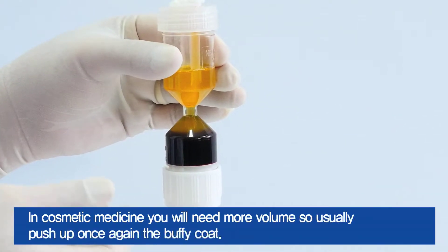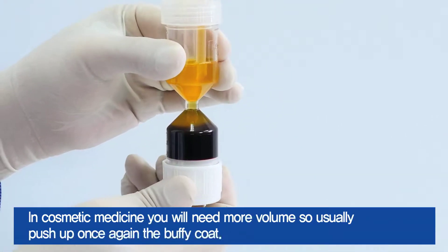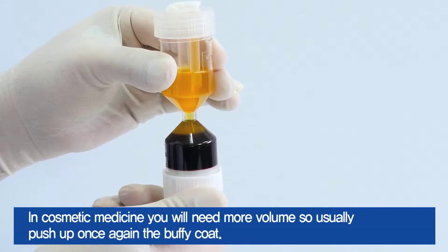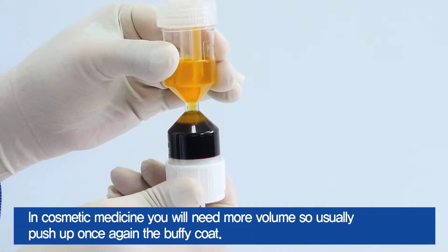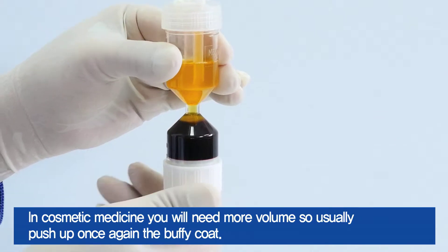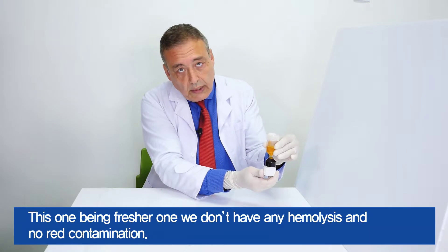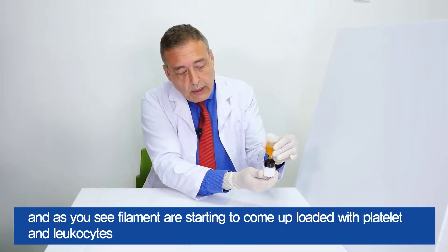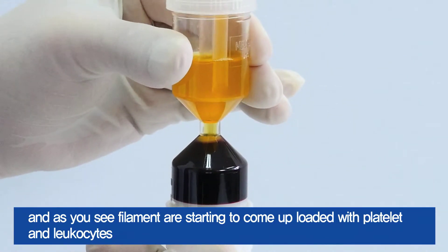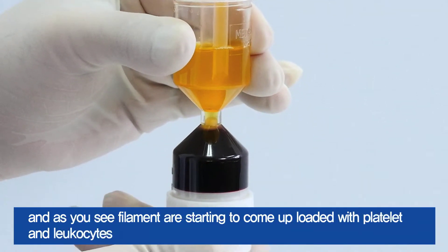In cosmetic medicine, you would need more volume, so usually what you're going to do is push up the buffy coat once again. Here it comes. This one being fresher, we don't have any hemolysis, no red contamination. And as you see, the filaments are starting to come up, loaded with platelets and leukocytes.